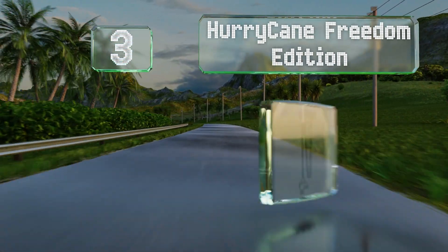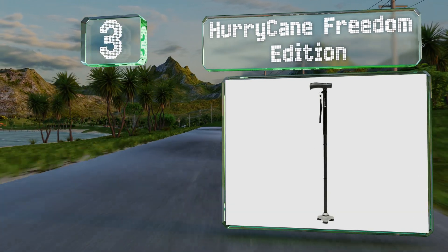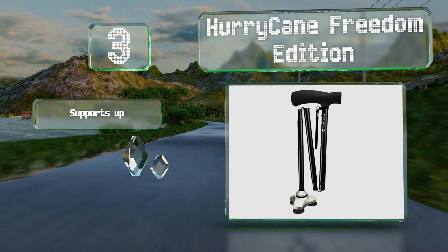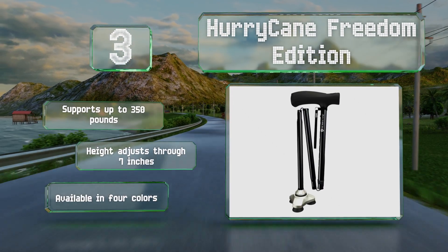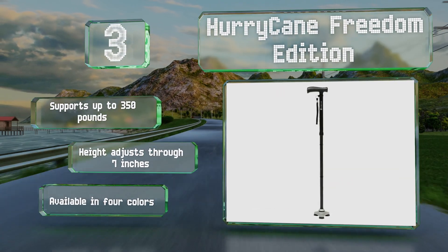Nearing the top of our list at number three, the HurryCane Freedom Edition has a flexible base that maintains contact with the floor at any angle, providing a firm footing that assists with stability. The shaft also rotates while the tip remains stationary to help with turning. This one supports up to 350 pounds, the height adjusts through seven inches, and it's available in four colors.